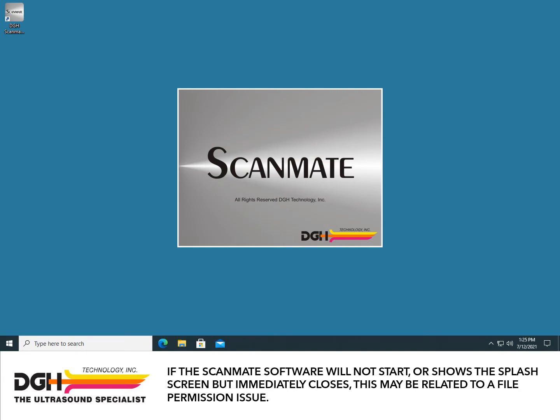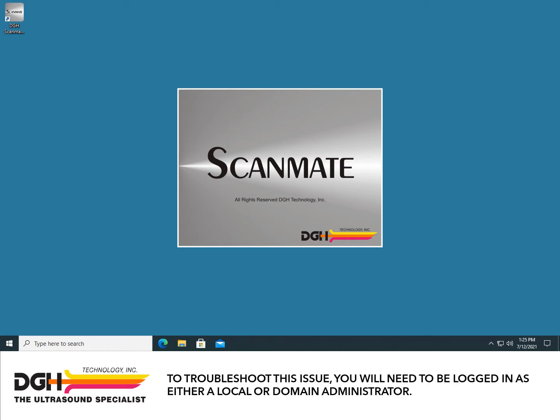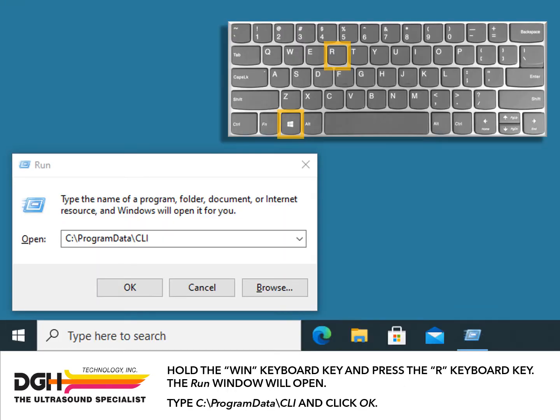If the Scanmate software will not start or shows the splash screen but immediately closes, this may be related to a file permissions issue. To troubleshoot this issue, you will need to be logged in as either a local or domain administrator. Hold the Win keyboard key and press the R keyboard key.